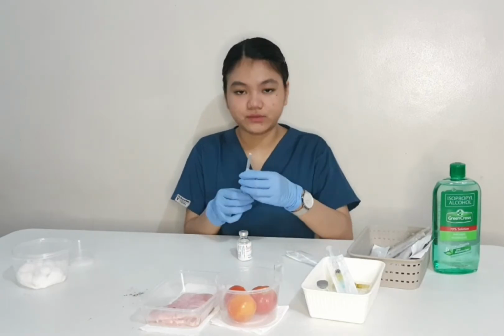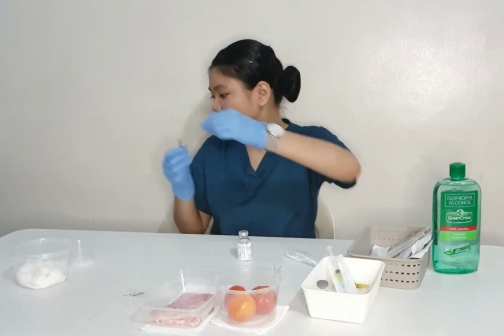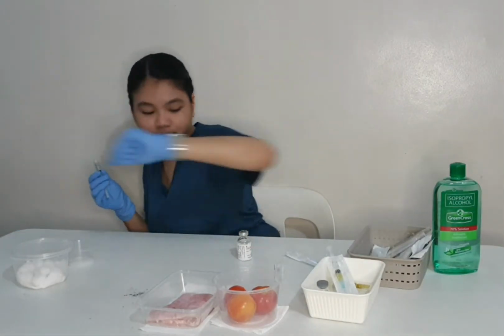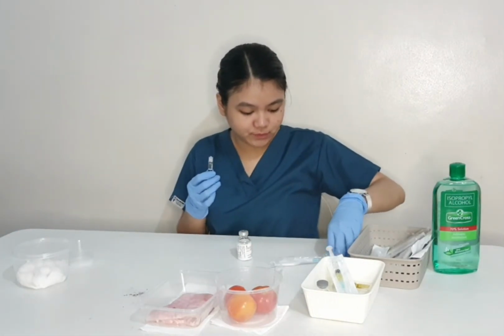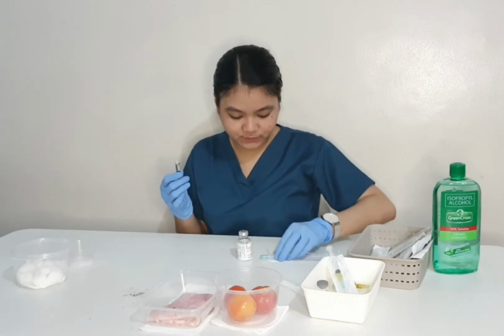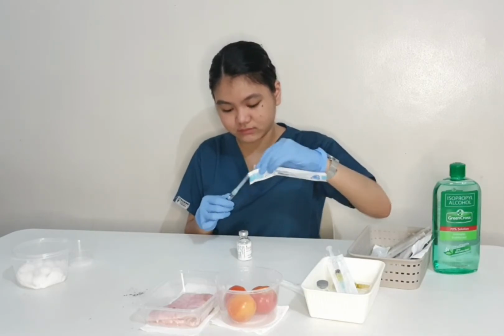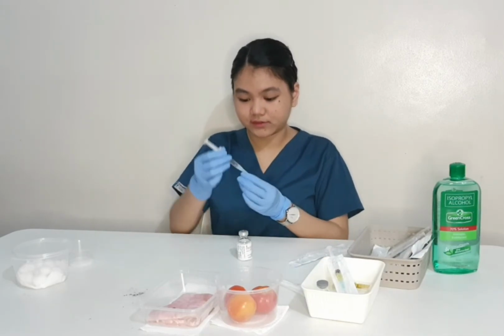So there you go. We have now 1 milliliter of vial. Let's throw it in a proper disposable bin. Let's change it into 23 gauge needle. Okay, there.